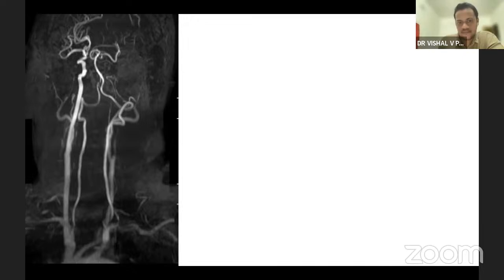So your minimum carotid diameter is what? At least 5 to 6 millimeters. Now, if you are going to use a React and aspirate a large clot, or go against a stent retriever of 4/20, obviously you need to know that not all your clots are going to get sucked. Correct? So the first thing I would like to know is, what am I dealing with?